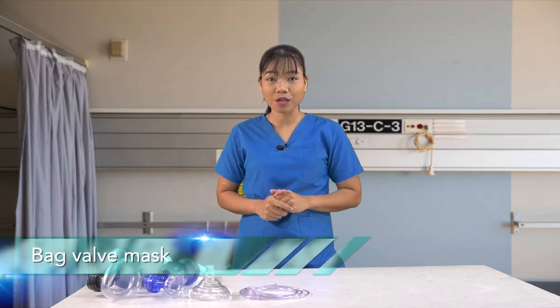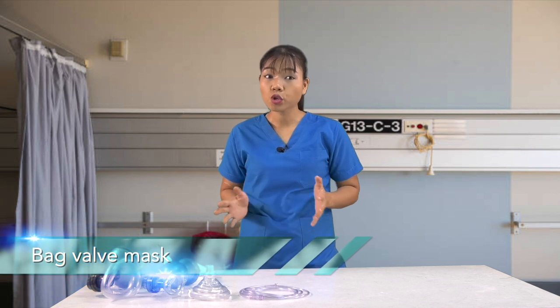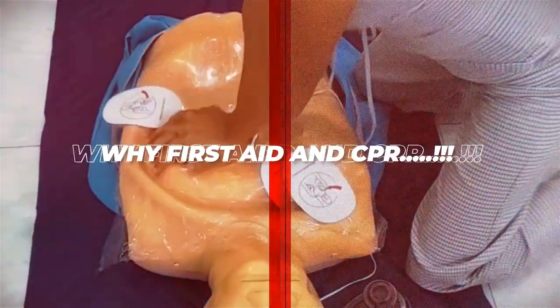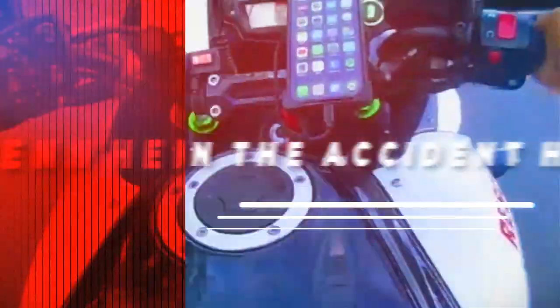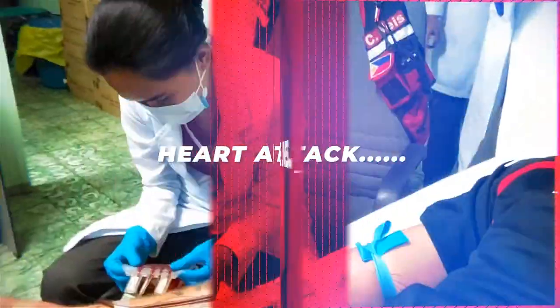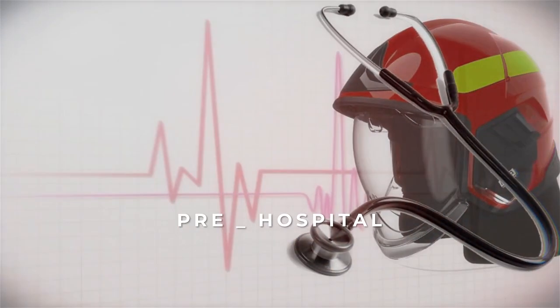Hello and welcome to pre-hospital trauma care. Today we will be talking about the bag valve mask: what it is and how it is used. In this lesson, we will focus on how to use the bag valve mask, why we might use it instead of traditional mouth-to-mask rescue technique, and any concerns that may come with using a bag valve mask.